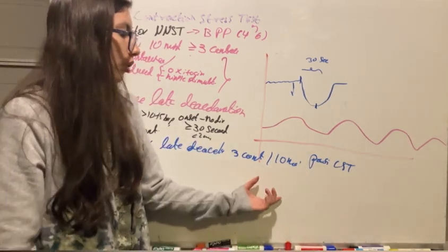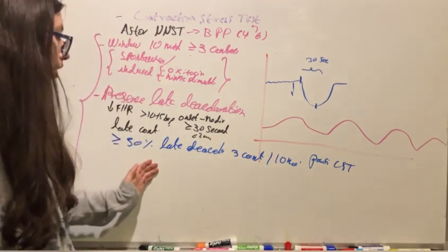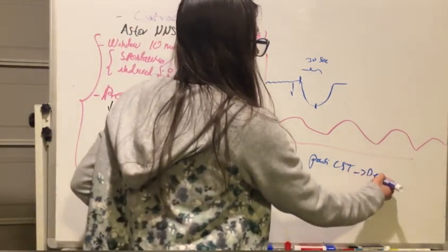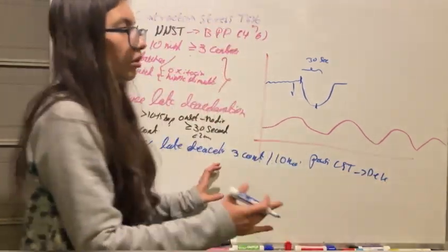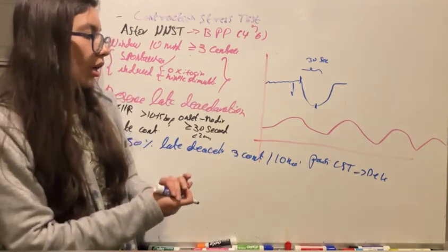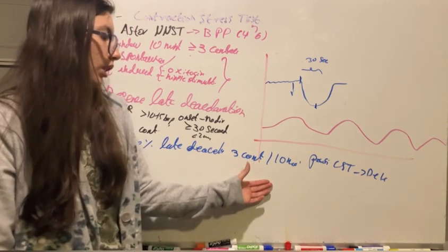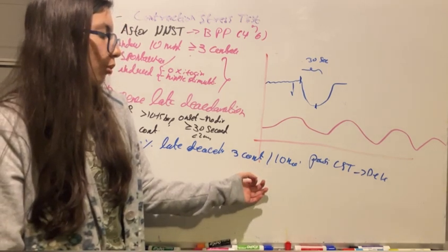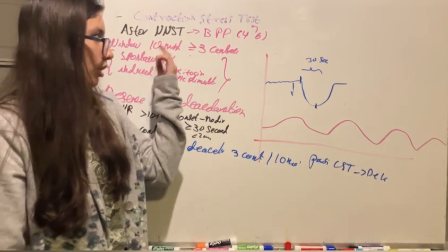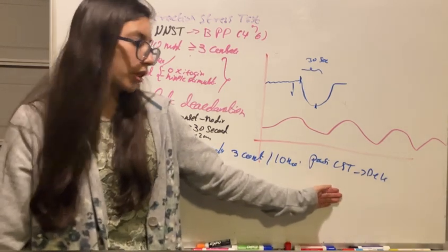This could mean that the fetus is hypoxic, and the management of this is prompt delivery, obviously depending on other factors like the gestational age and if indeed the fetus is hypoxic. But most of the time, if we have a positive contraction stress test, especially if we have a non-reactive non-stress test, the management should be delivery.